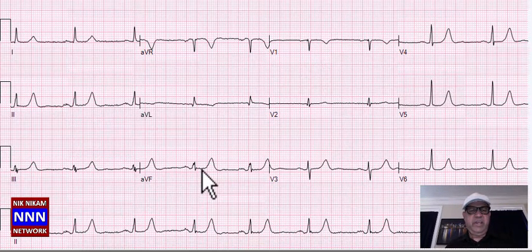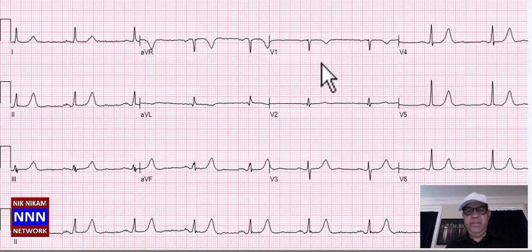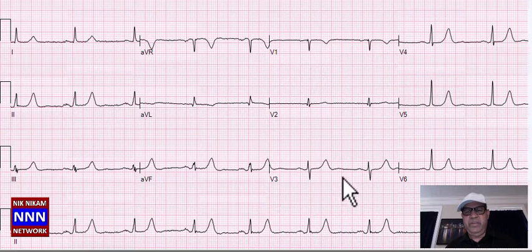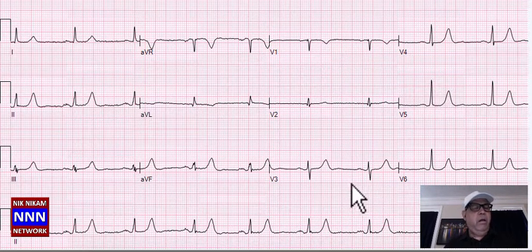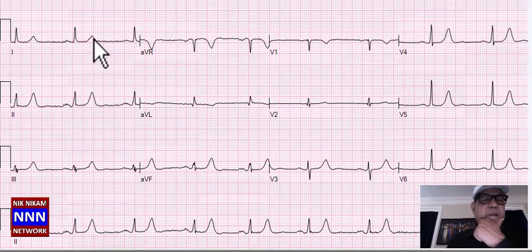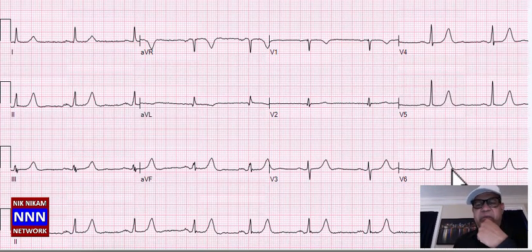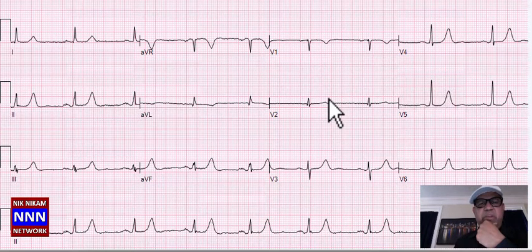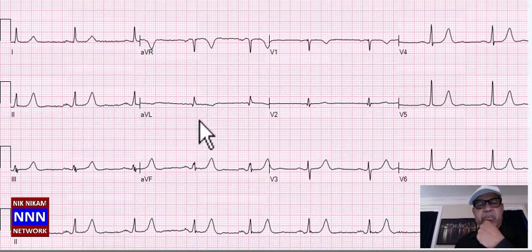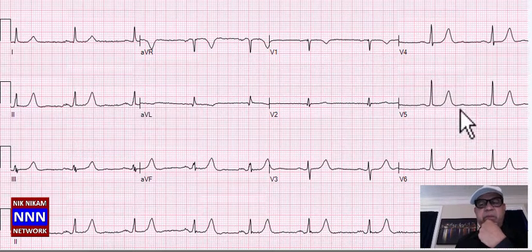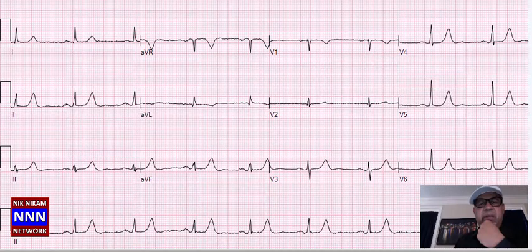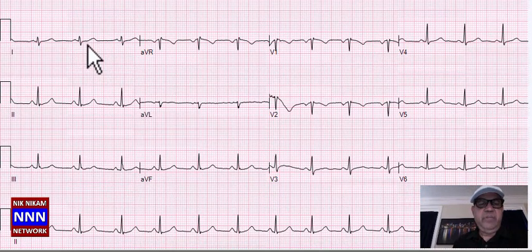Sinus rhythm, inferior leads with little ST-T abnormality, anterior leads with okay R-wave progression. Actually this is sinus bradycardia — rate is only 52 — with some non-specific T-wave changes but nothing really significant. No evidence of old infarctions or heart blocks. Lateral leads look okay.